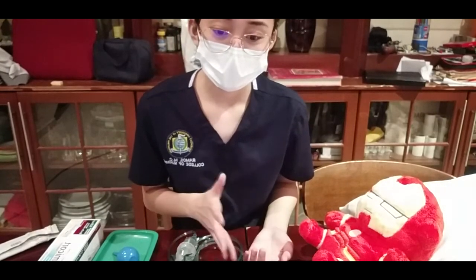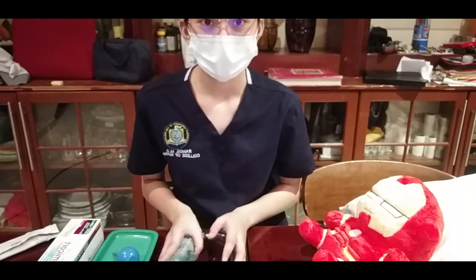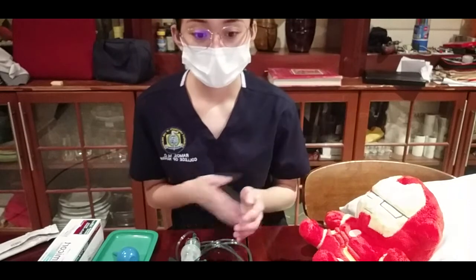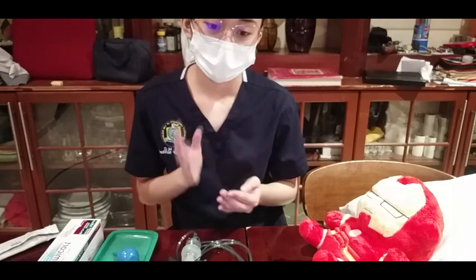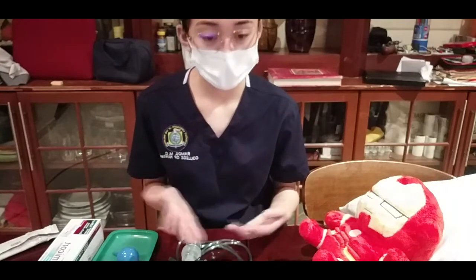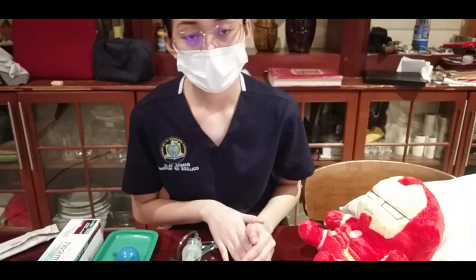Next off, I will be choosing appropriate equipment for the patient's specific needs, and since we are out of equipment here, I will be using this, and this ensures safe and accurate oxygen administration. Next, I will also be checking the environment for safety, and this helps to know that oxygen supports combustion and we are avoiding that. Any smoking, open flames, electrical equipment that emits sparks, synthetic fabric that builds up static electricity, and oils are not permitted around any oxygen delivery devices inside the hospital.